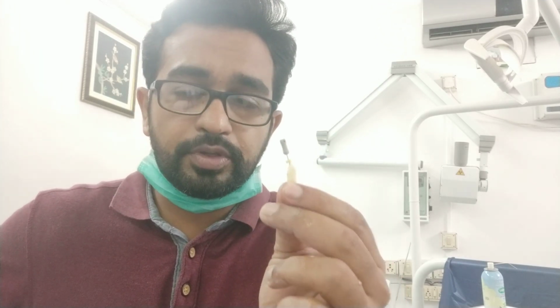So what I have to do now, and one very important instrument you should have in your clinic is the apex locator, and the radiograph, whatever you want to have. In your initial practice, even if you don't have an apex locator, you can skip it for a few days, like 6-7 months. After you get some money, then you can buy the apex locator. It will be very easy for you. You don't have to take the working length x-ray, and you all know there is a principle of taking x-rays which is known as ALARA, as low as reasonably achievable.